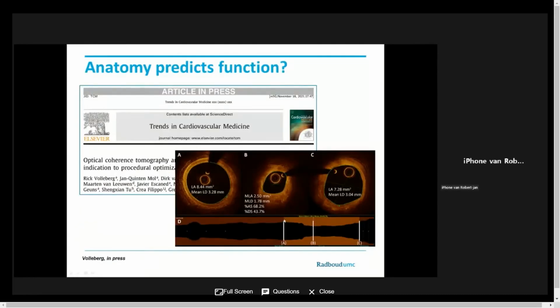So I think that's talking to you about erosion and it being possible to be identified just on anatomy. It's a really important thing because it might change your treatment strategy. But over the recent years, we can also see that anatomy, based on the OCT, is predictive to make decisions on PCI or not.